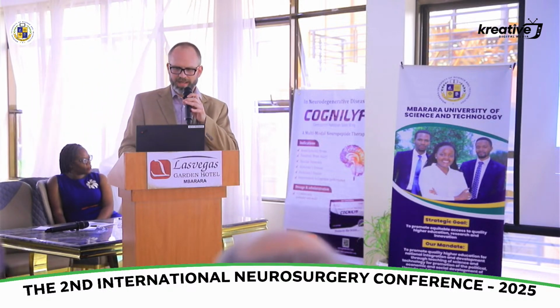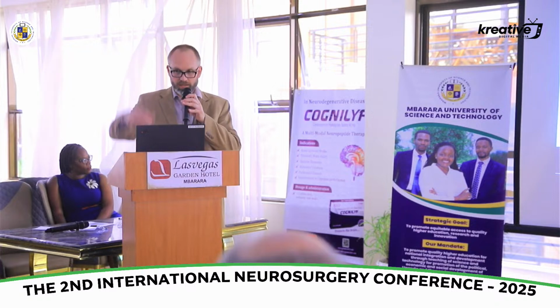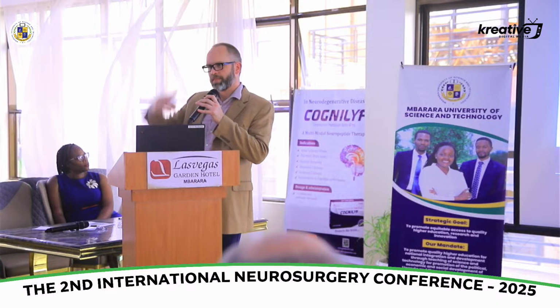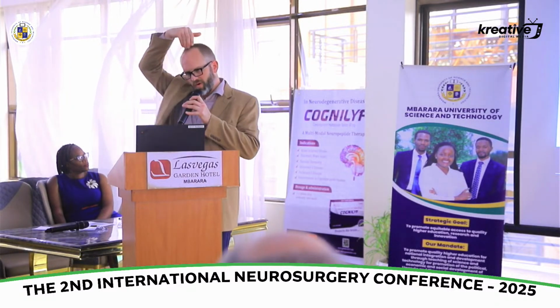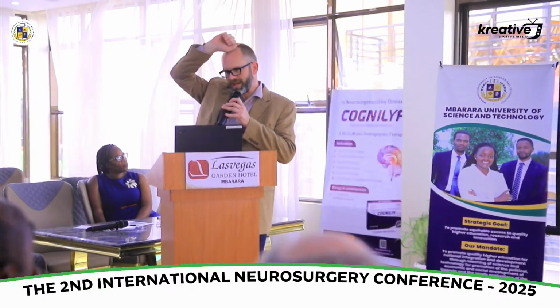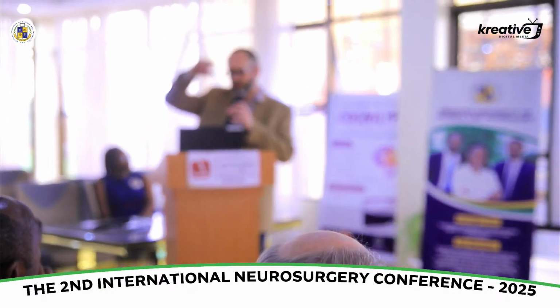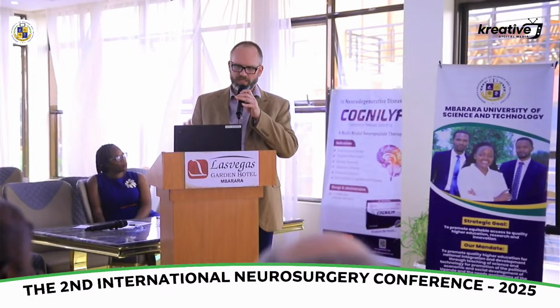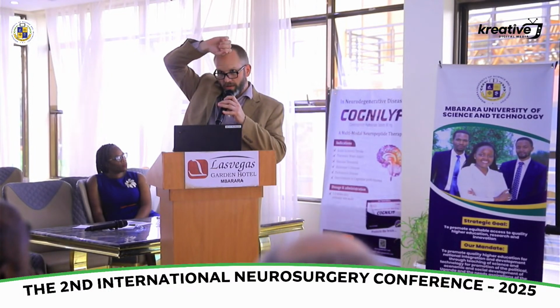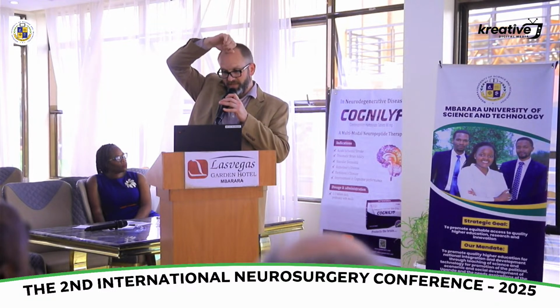So if we think of the anterior fontanelle, you're going to have two images. You're going to have a sagittal or a coronal view, and there's a direct coronal, but then if you want to see the whole brain, because you just have one little window to look through, what sonographers do when they look at infant brains is they have very specific views they look at.